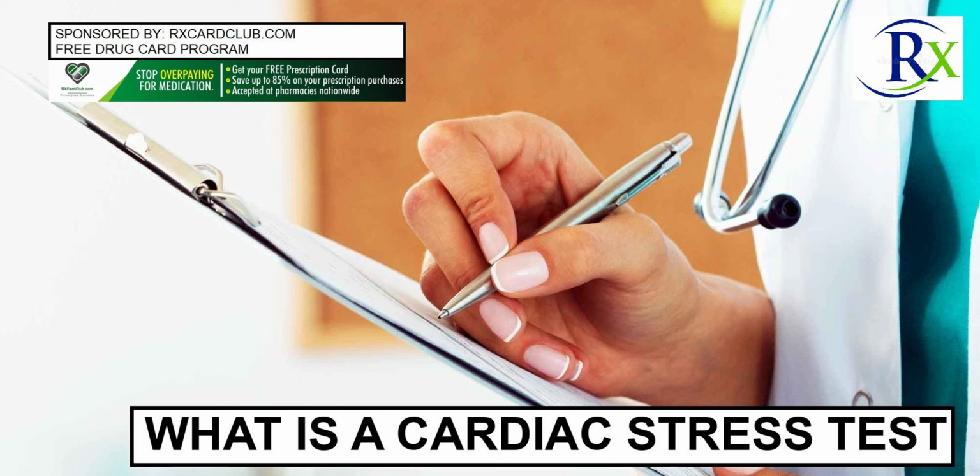After the lab technician has determined that your pulse and blood pressure have normalized, the blood pressure cuff, pulse oximeter, and ECG leads will be removed. You can then change back into your clothes and freshen up in the restroom. If you have diabetes, this is the time to use your glucose meter to measure your blood sugar level. If it is abnormal, advise the technician, nurse, or attending healthcare provider. After the stress test, if you do not feel well for whatever reason, do not leave the office. Tell someone on the medical staff and let them check you out to ensure you can safely go home.